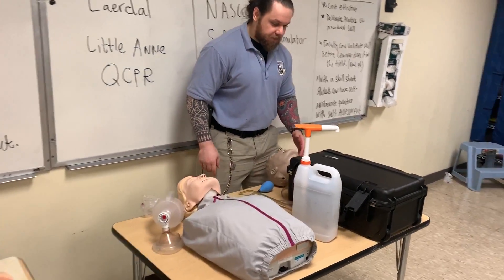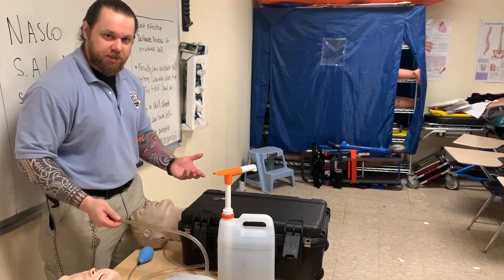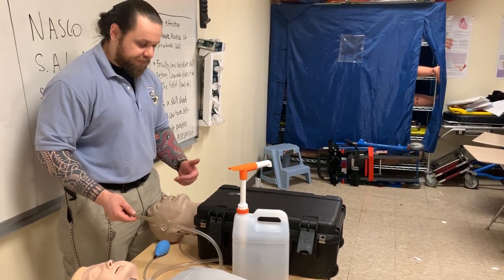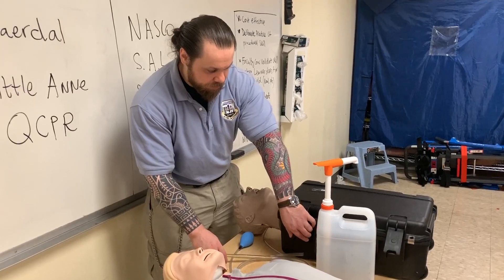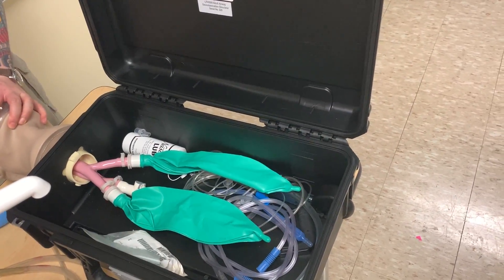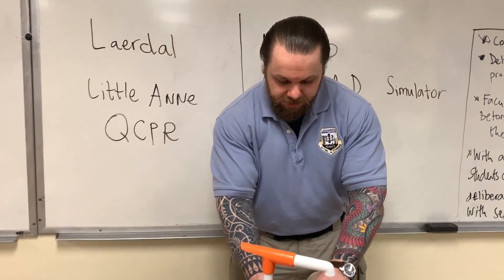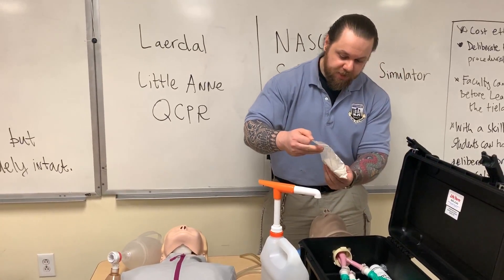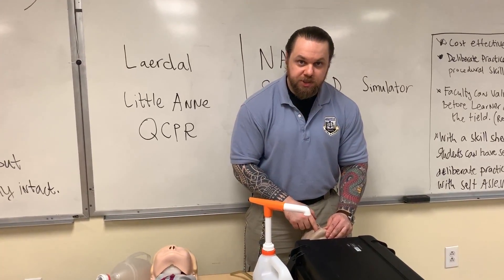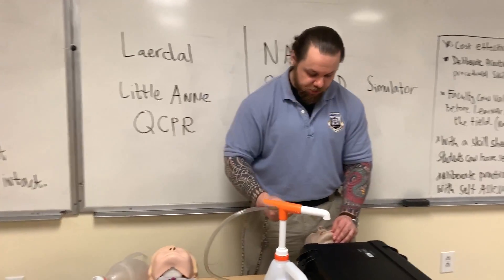Here we have a NASCO SALAD mannequin. SALAD stands for Suction Assisted Laryngoscopy Airway Decontamination. It's used for performing advanced airway management while the patient has vomit or blood in the airway. You could still use it in your BLS stations. If you look inside the box, there are lungs, and if you ventilate the patient you do have inflation, but that is not what this mannequin is intended for. The purpose is to run fluids — you can mix coloring like blood or vomit — then pump it so it will contaminate the airway.